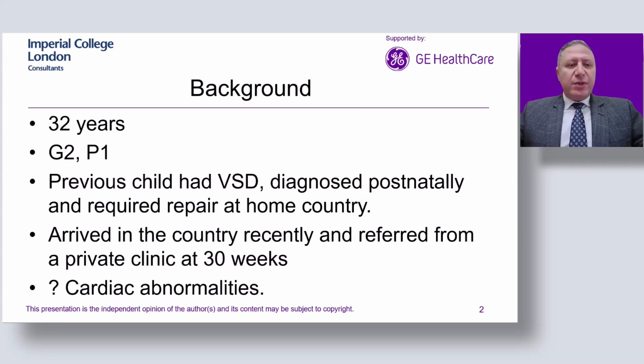This is a 32 years old patient who just moved recently into Qatar. She was in her second pregnancy. She gave a history of her previous child having had a VSD, which was diagnosed postnatally and required repair at her home country. She arrived at around 30 weeks of gestation, and she had her first ultrasound scan at that point in a private clinic. And she was referred to Sidra MFM for a second opinion.